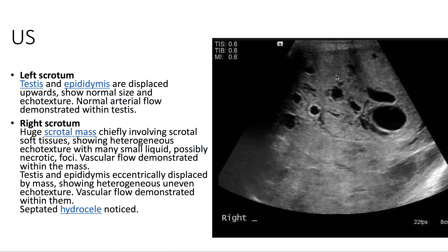On chest X-ray, we see a large oval mass in the left hemithorax. Its epicenter is in the left upper lobe, and it displaces the trachea to the right. It creates a silhouette sign with the left upper heart border.